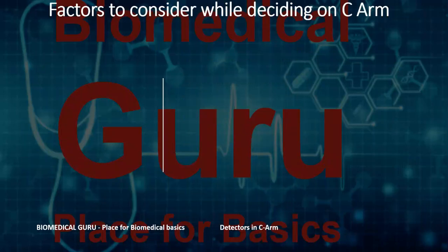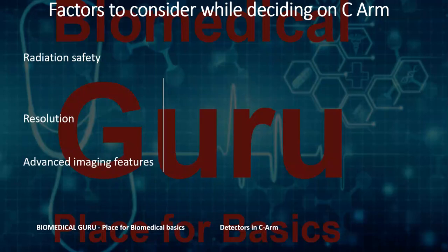And what are the factors that you need to consider while buying a C-arm? These are the three factors about which we need to think when we buy a C-arm. One will be the radiation safety. You need to understand what are the kind of procedures you use and what is the DAP at that particular procedure. Second is the resolution.